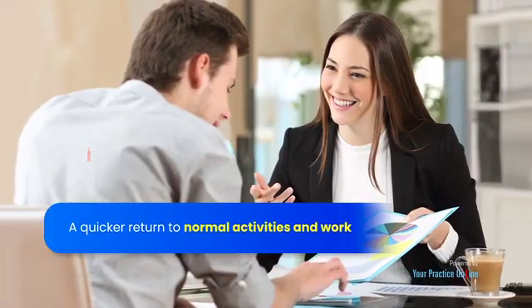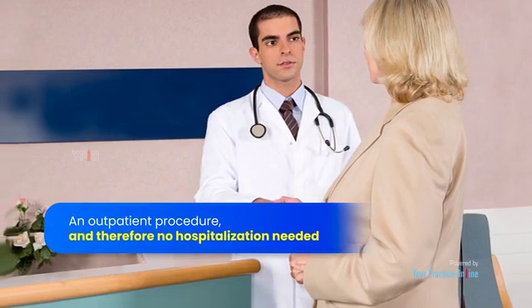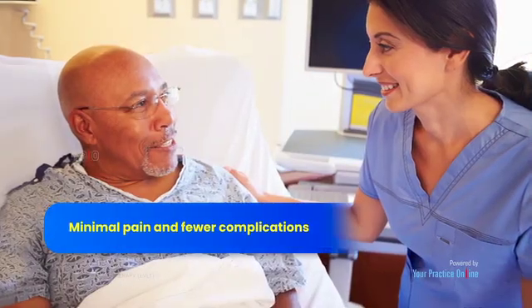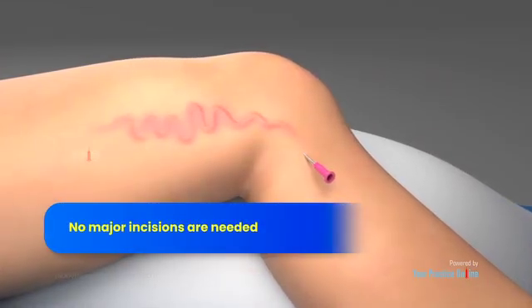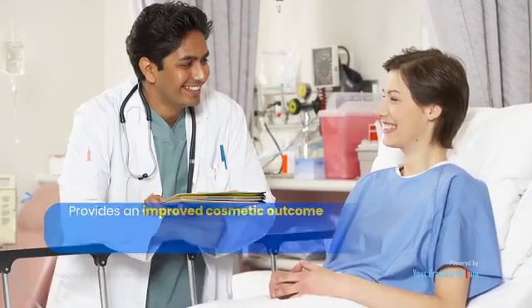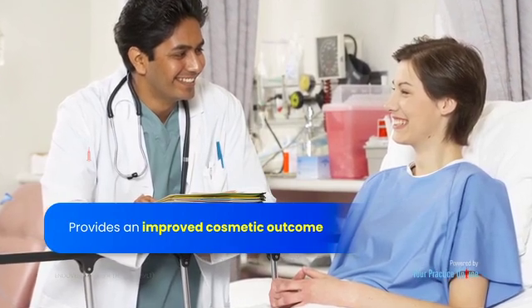Benefits. Some of the benefits of endovenous laser therapy over the traditional vein stripping procedure for varicose saphenous veins include a quicker return to normal activities and work, an outpatient procedure, and therefore no hospitalization needed, minimal pain and fewer complications. No major incisions are needed, just a small nick on the skin that does not require stitches. Generally safe and provides an improved cosmetic outcome.